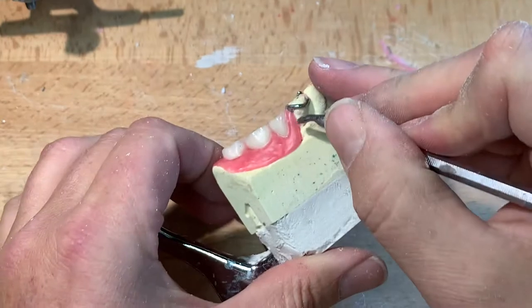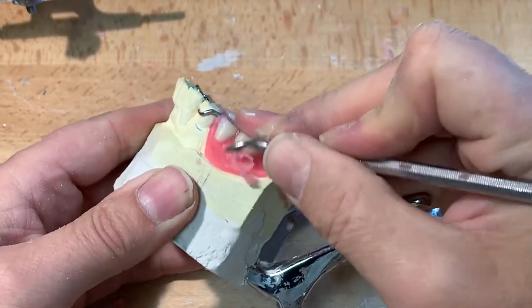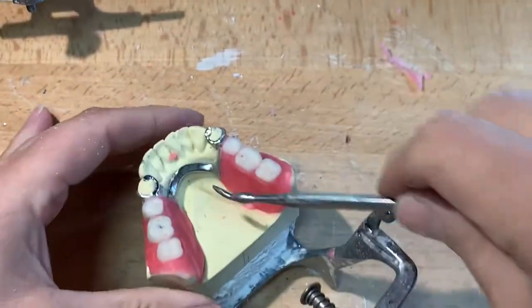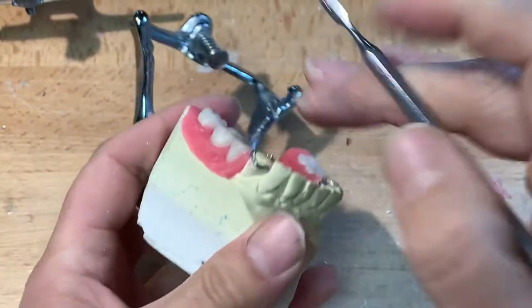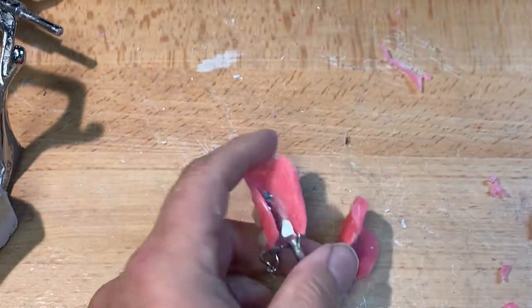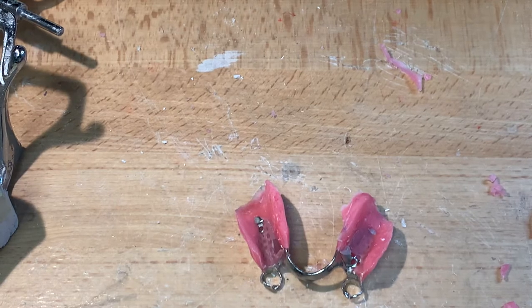I just heated the wax up a little bit — it made it a little easier to festoon, carve, and shape. This is for trying, remember. Now I'll take the framework off and do the flanges — be careful not to bend any clasps or wires. Now we have the denture in wax. I've got a few voids under there, but the denture should simulate that of an acrylic partial, meaning the acrylic flanges should be replicated in wax.